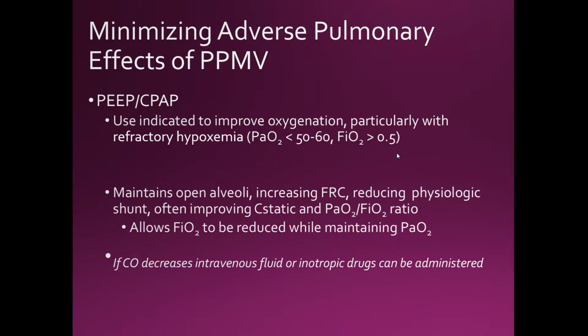Okay, so PEEP or CPAP maintains open the alveoli, increasing FRC, reducing physiological shunt, often improving static compliance and PF ratio. So it does improve oxygenation in so many ways. It allows FiO2 to be reduced while maintaining a PaO2.